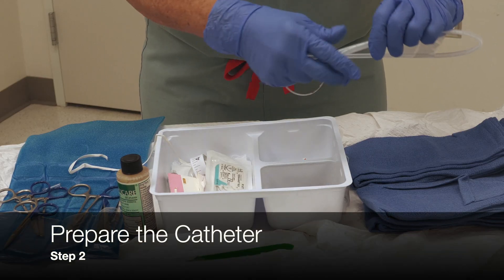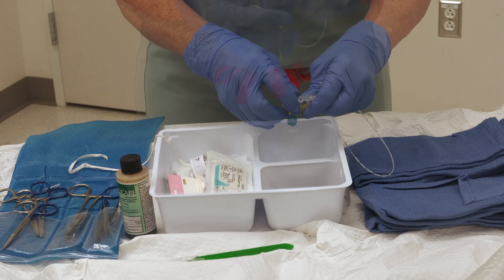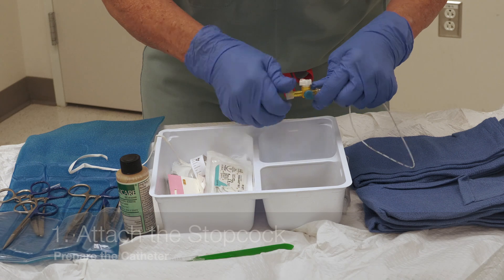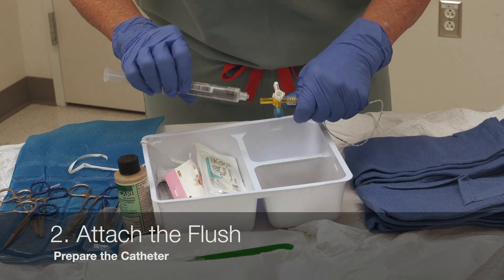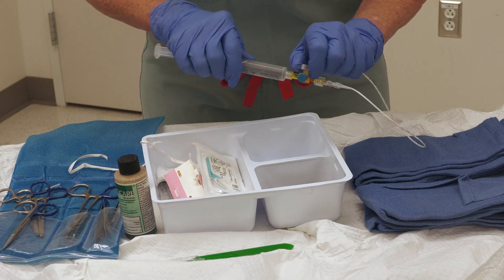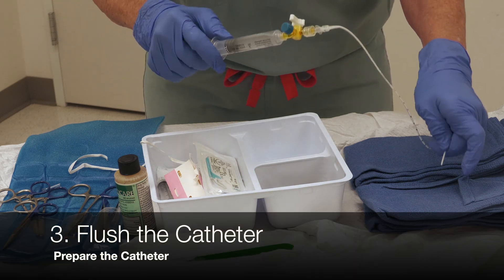Next, there are three steps to prepare the umbilical catheter. One, attach a three-way stopcock found in the UVC tray to the catheter. Two, attach the normal saline flush to the stopcock. And three, flush the catheter.